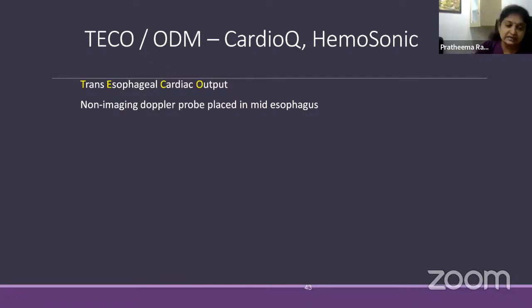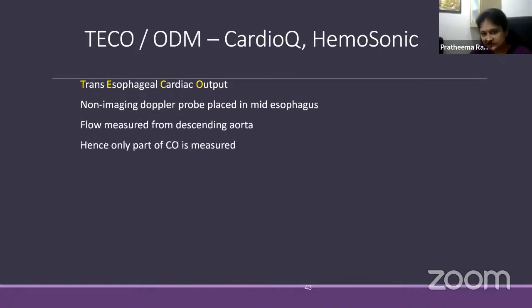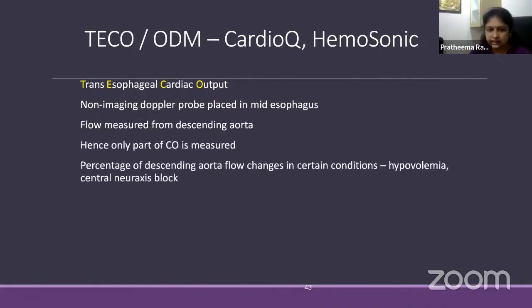In TEE, where we put the trans-esophageal probe into the esophagus, we see the images. But in this, we see only the Doppler, and it works in a similar way as the USCOM. This is minimally invasive. If we think Ryle's tube or endoscopy is invasive, then it is invasive.